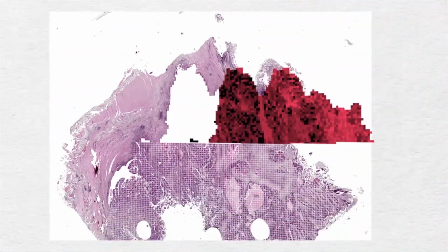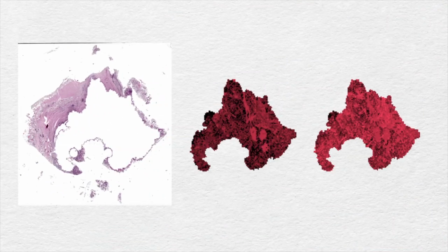All 40x tiles are processed individually by a convolutional neural network, termed a DoMore v1 network. Here we see the first tile being processed. This network consists of a representation network and a pooling function. After all tile representations are computed, the pooling function collects all tile representations and performs an operation, reducing them to two numbers. A pair of values is calculated for each tile and registered in respective heat maps. This concludes the first network.